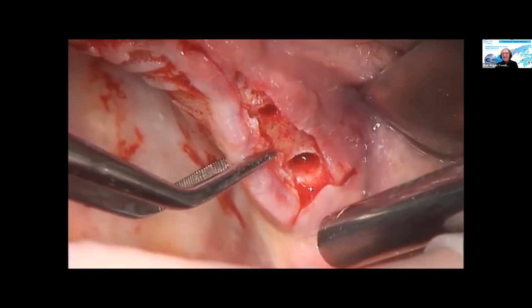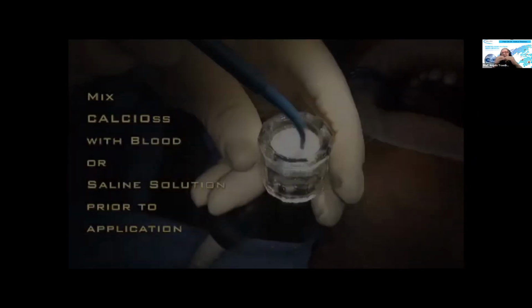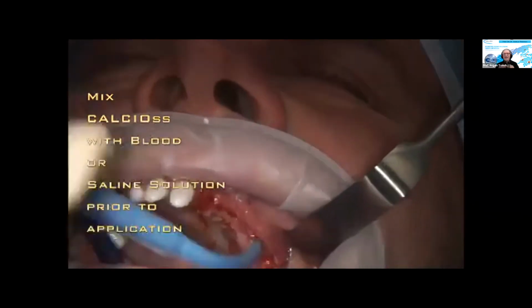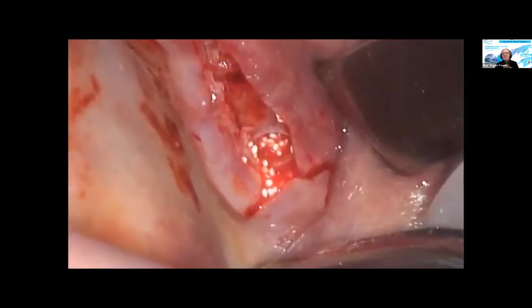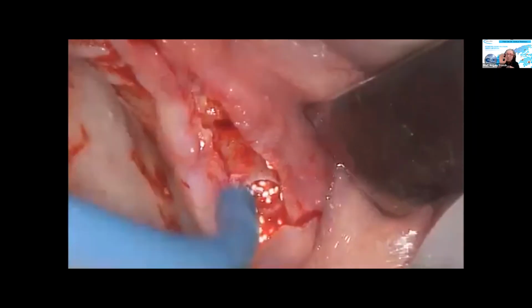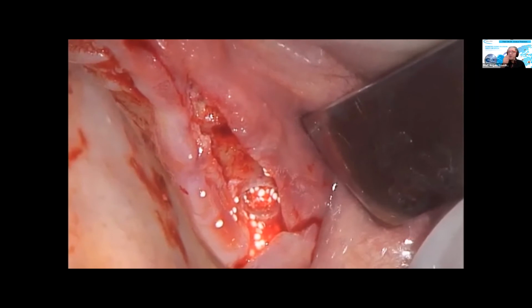And once again, you can see the patient is breathing. At inhaling, the saline solution goes in. At exhaling, the saline solution is pressed out of the intact subantral scaffold. So then we're going to place the bone graft material. And as you can see, we have only one small approach. In this case, it's a little bit wider than 2.8 millimeters because we use the drill.